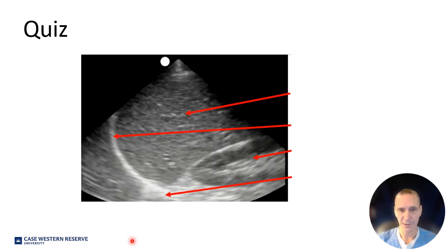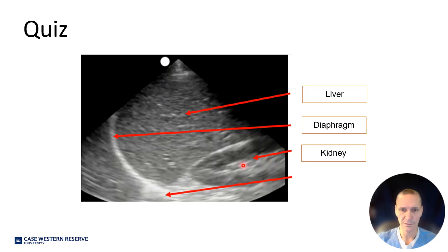You should know these areas. This is the patient's head. Indicators towards the head, we have the abdominal mode setting. This is the patient's feet. This arrow is the liver. This is the diaphragm. This is the kidney. Here is the spine. And we are saying to ourselves, I do not see the spine carrying towards the head, but I know it's there. We're seeing mirror artifact. So this lung is up. There's not a pleural effusion. There's not a hemothorax here.